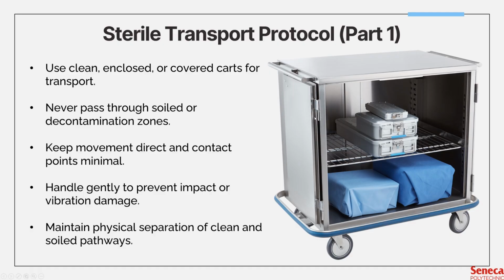If you had a case cart and you had to bring it up to the OR, for example, you never pass the decontam area. There's no reason for you to go through there. For that reason, hospitals will plan routes so movement is direct and minimal, avoiding unnecessary handling.